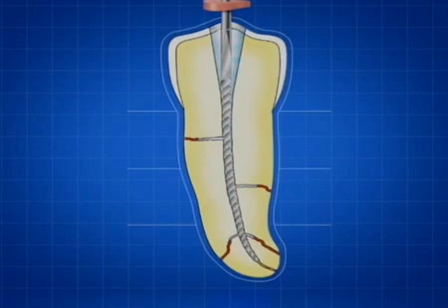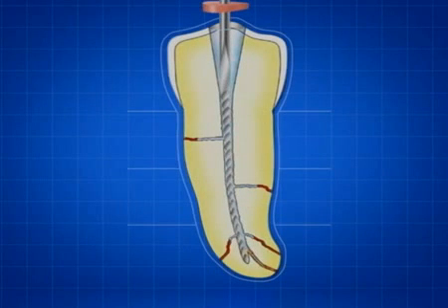Generations of dentists have been trained to work short of the radiographic terminus. Every dentist who has worked short has experienced the frustration of an apical blockage. A loss of working length occurs due to the compaction of collagenous tissue apically and/or the accumulation of dentine mud. In the instance of the lost foramen, many clinicians become frustrated and aggressively attack the obstacle, which serves to inadvertently condense and pack debris apically. Working arbitrarily short of the radiographic terminus in an apically blocked canal predisposes to a ledge.